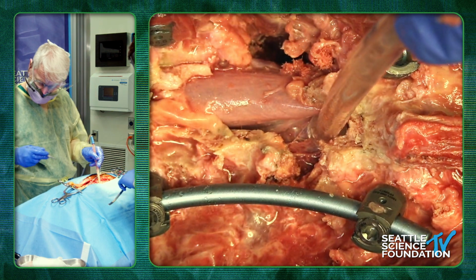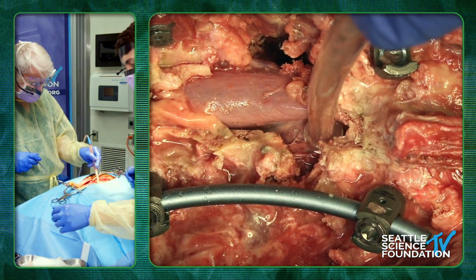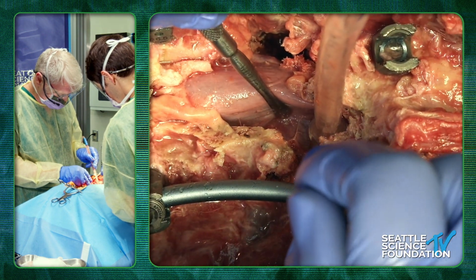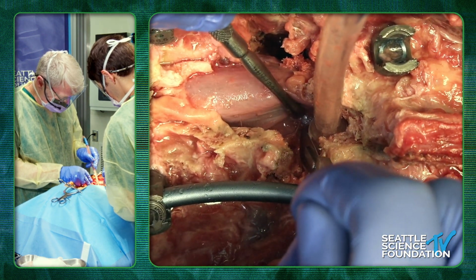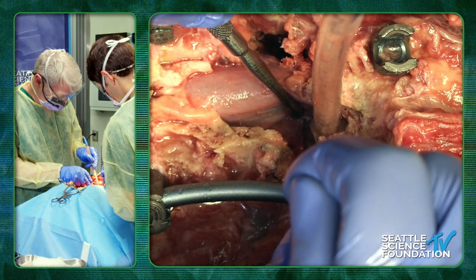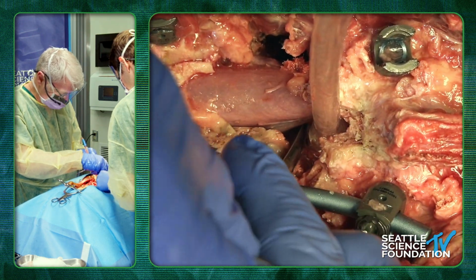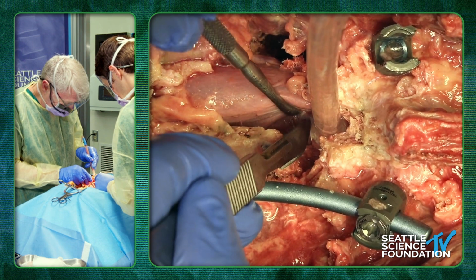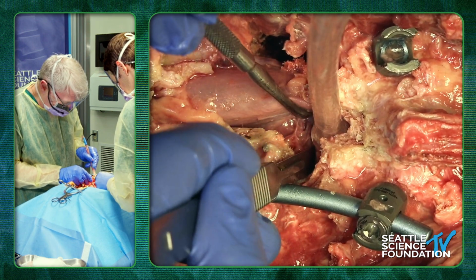Okay, so why don't you take a knife and find the disc space, because we've cut through the disc space. The disc space will be right here. Towards me. Start medial. Yeah, and then come towards you. Yeah, and I think the disc is that way. Can you cut in? That's it. So he's in the disc space now.